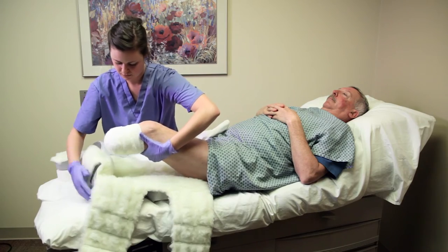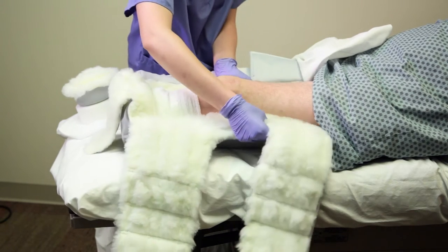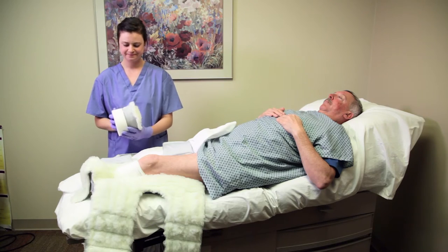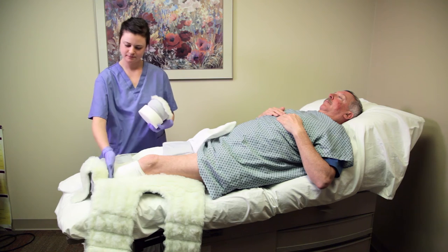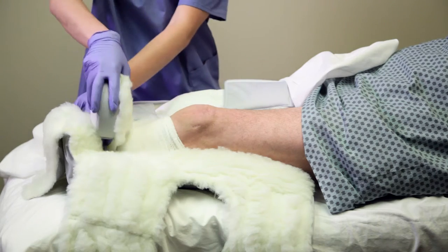Place the patient's leg in the dressing so the patella is placed directly in the middle of the device. Included with the Rook BKA dressing are two foam spacers. Use the foam spacers on the distal end to keep the patella directly in the patella window.